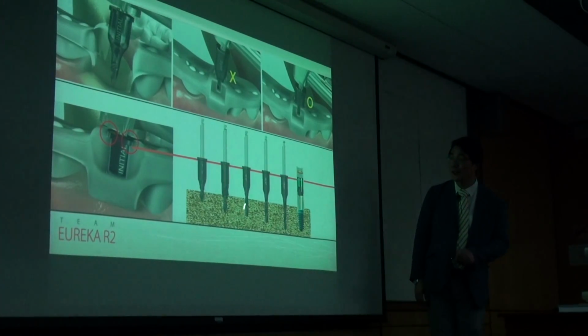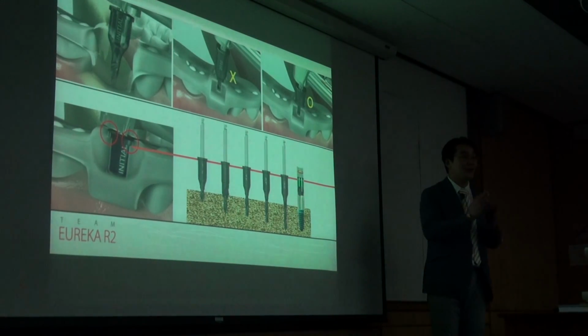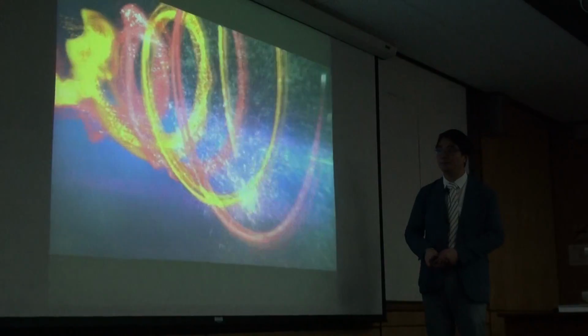And gradually increase the drill length using the 2.0, and then increase the drill diameter. So, based upon this concept, I started the surgery.